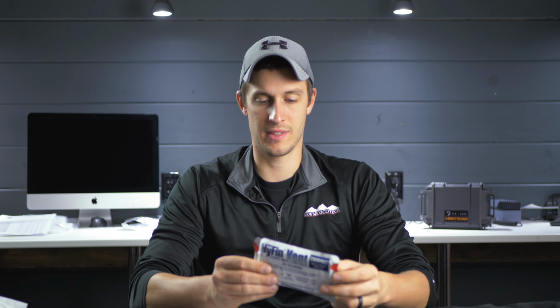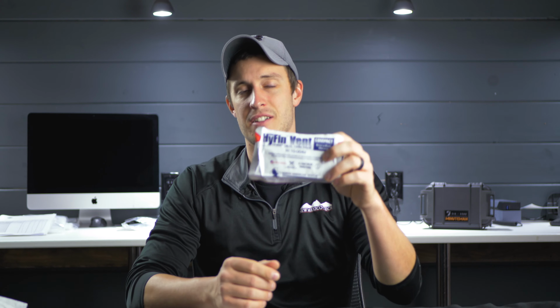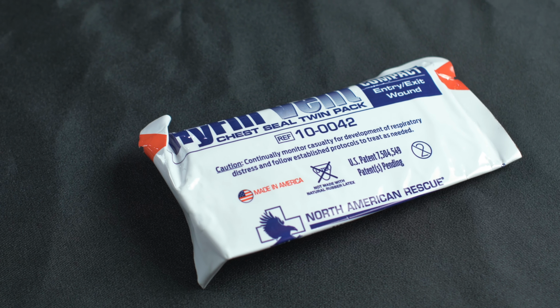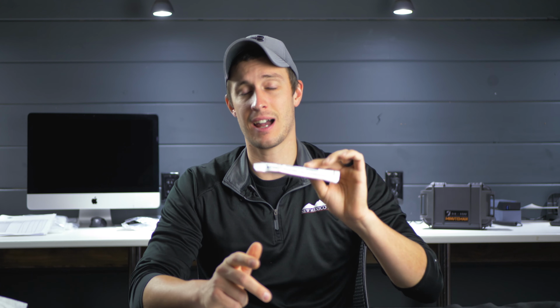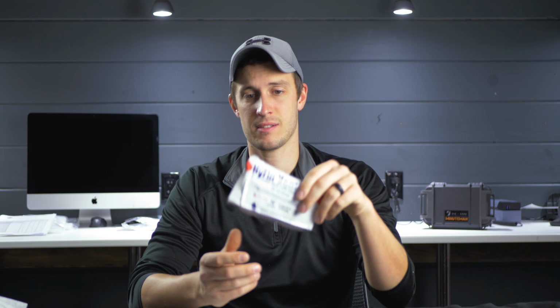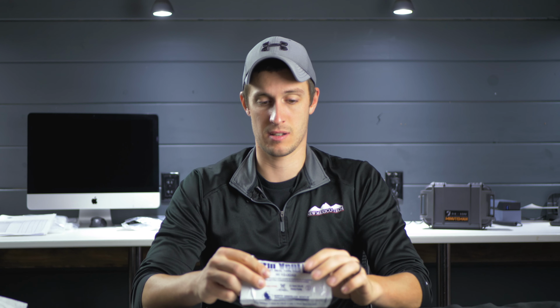Next up, we have one that's a little over a year old, about a year and a half old now. This was manufactured May 27th of 21. This has been in a vehicle first aid kit. So it has endured last winter and then all through this past summer inside a hot vehicle. And now it is 45 degrees outside, so definitely not hot now, but it has been sitting in a hot car all summer. So that one's about a year and a half old.